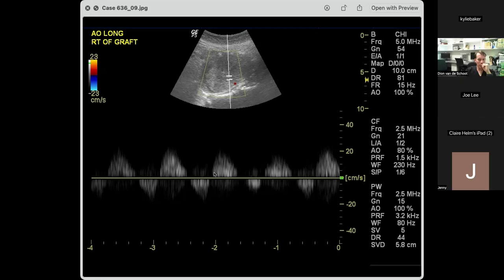There's a lot of argument in the literature as to whether ultrasound contrast is sufficiently good, and that aortic stent observation and follow-up could be done with ultrasound contrast rather than repeated CT, because there is some speculation that one of the reasons that there is no better long-term survival between open repair and endovascular repair is that the endovascular repairs require repeated doses of contrast, and eventually that catches up with people, knocks off their kidneys, and so their long-term mortality removes the early mortality benefit that you get from endovascular repair, the operative advantage of it. Okay. All right.